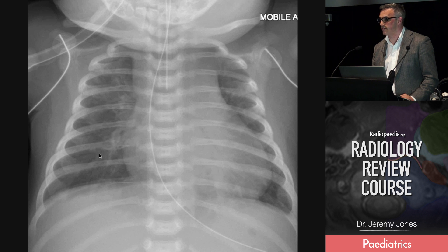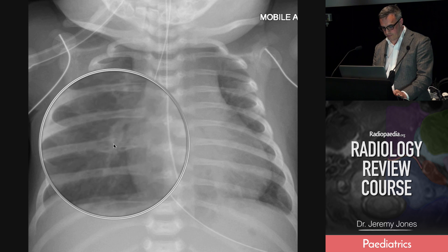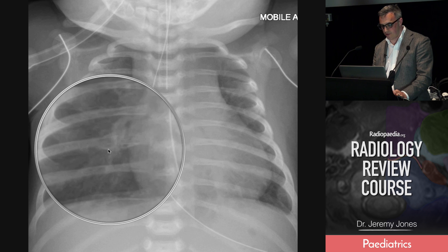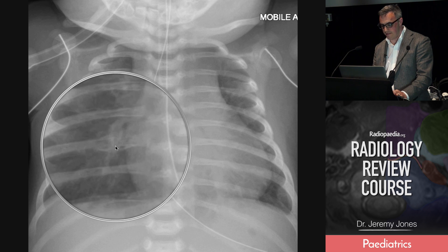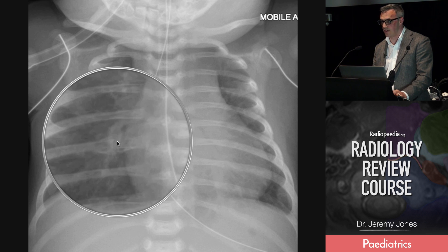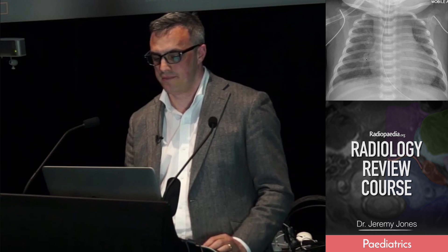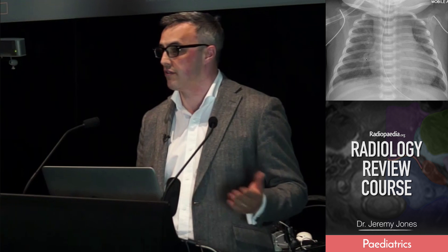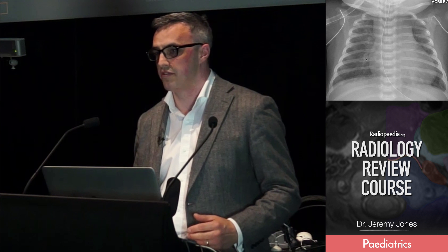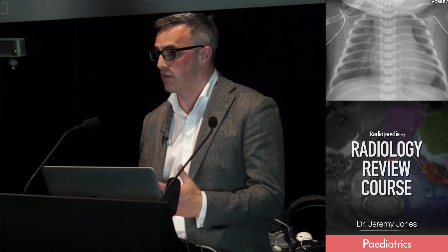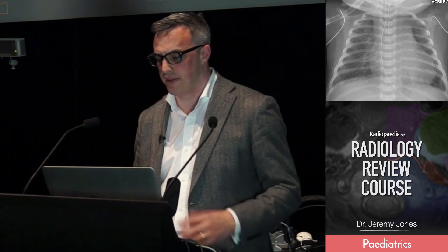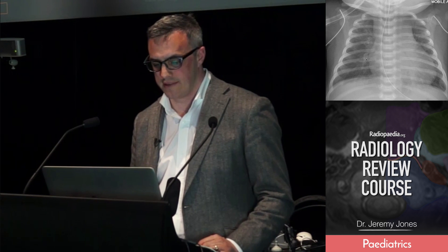When we get down here, we see that this rib is expanded. There's lucency underneath that lifted bit of periosteal reaction, and with the eye of faith you can also see a little rib fracture in there. This is never normal — either it's the result of inflicted injury, or it's because of handling in bones that are soft and weak for another reason. Either way, they need to be further investigated.